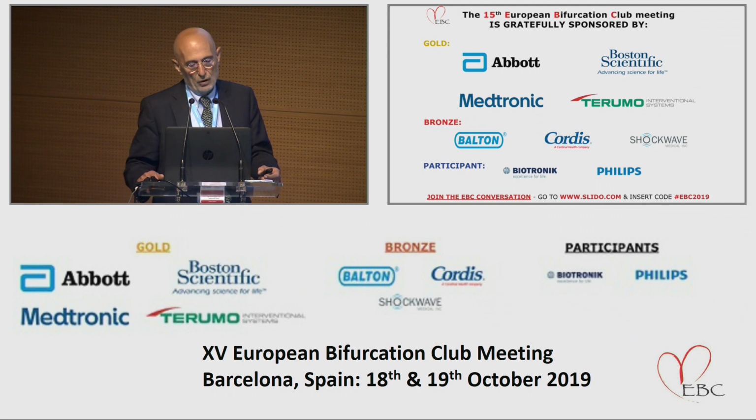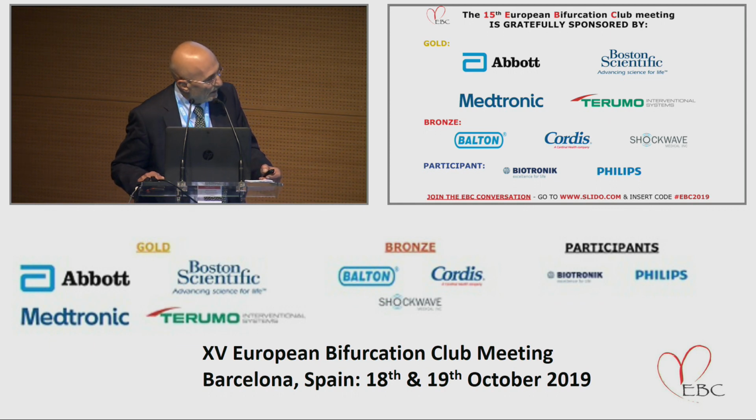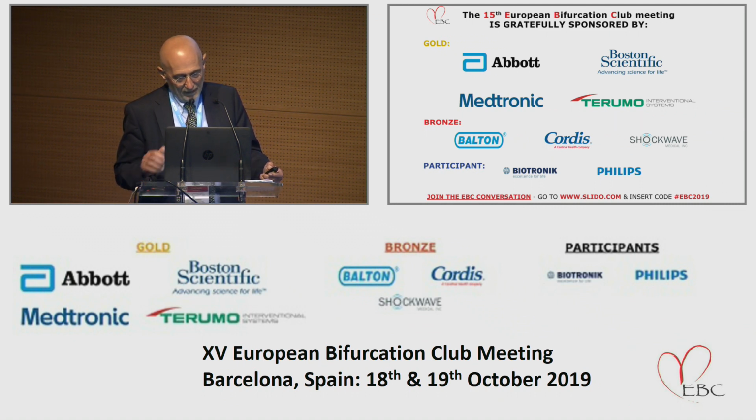And if we look at EBC recommendations, you can see that when you have some concern about the side branch, DK crush is indicated as a quasi gold standard, or you can also move to other approaches, but no other kind of crush is indicated there. So only DK crush from the family of crush.